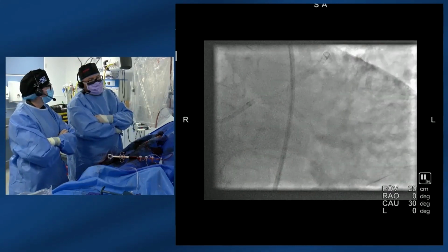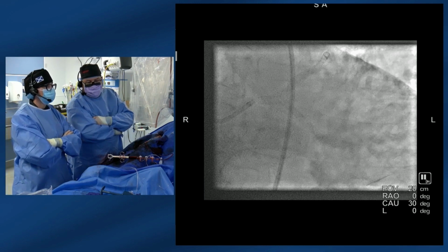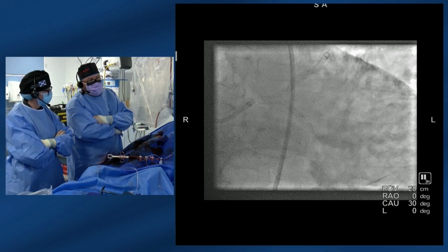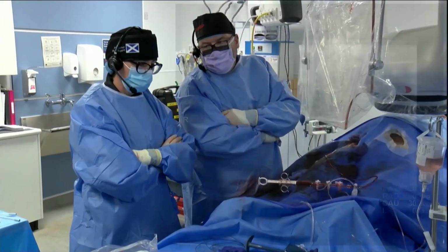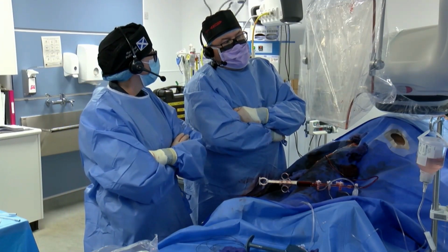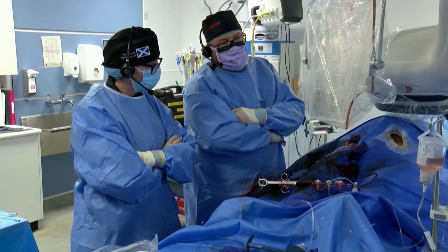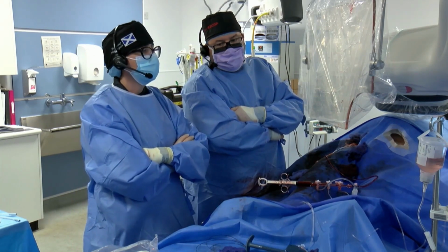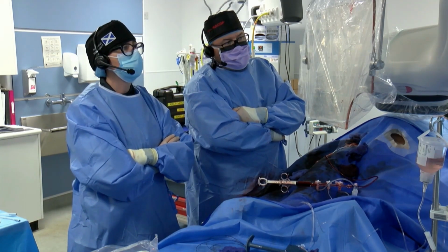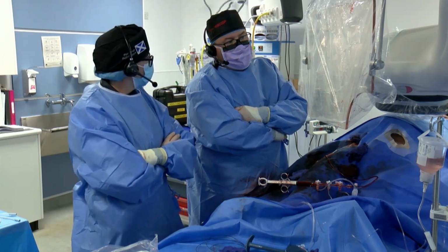I think it's also shown that even if the arterial disease is so bad that you can't get the OCT catheter past it all, even getting it partially down the vessel was quite helpful in the LAD, showing us the left main stem. So all in all, I think using the OCT guidance, using the PCI Assist software to do stent vis and stent vessel vis, it's been really, really helpful. Yeah, I agree. Okay, well, thanks very much.